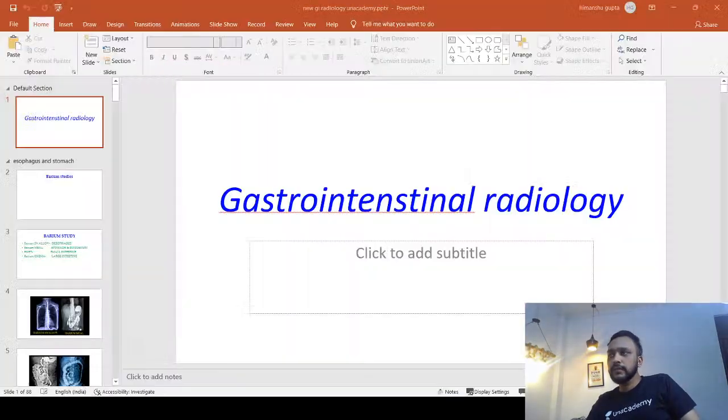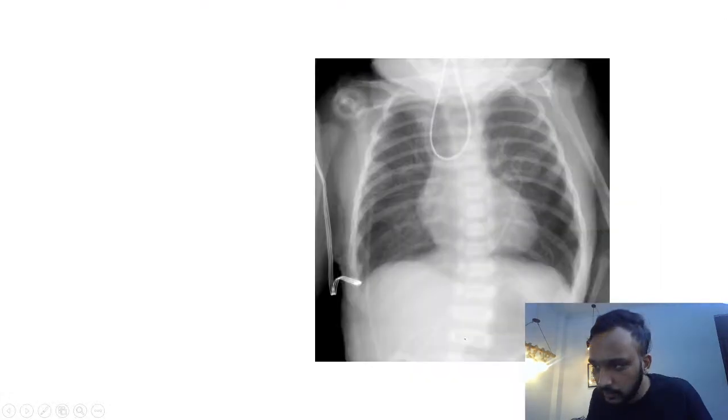So now guys, coming back to the images, right? So guys, what was this case?